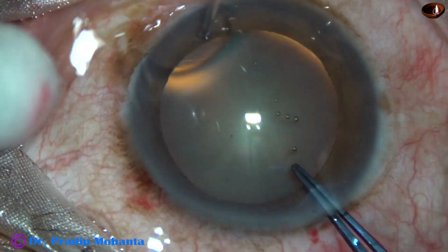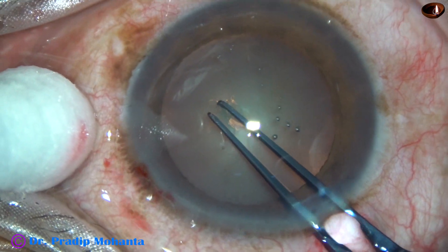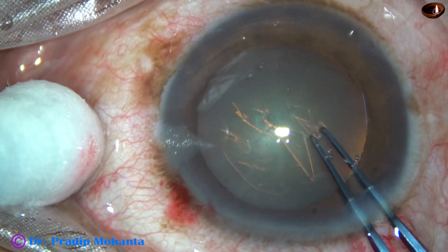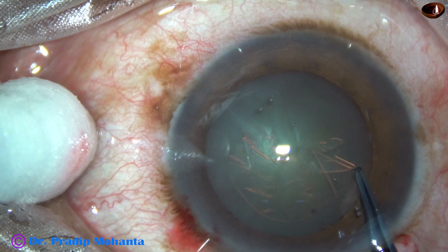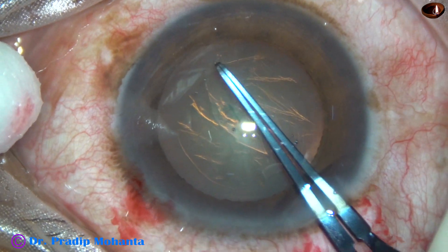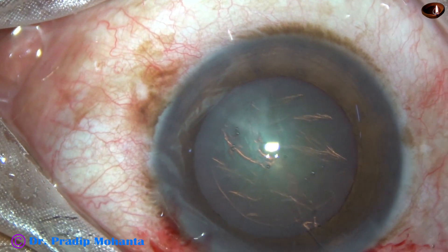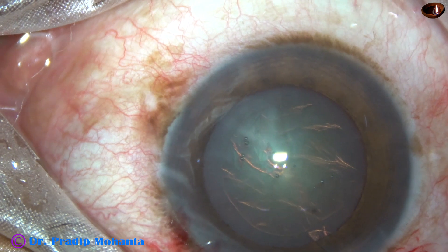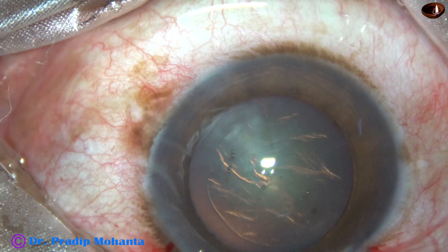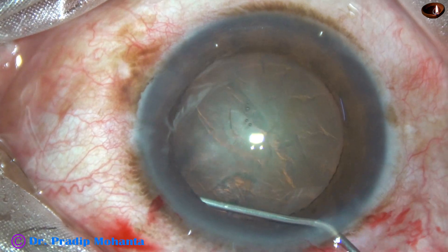Now I'm going to do capsulorhexis. The anterior capsule is torn, a capsular tag is raised, and this capsular tag is guided with the forceps to get an adequately sized rhexis of about 5.5 millimeters. For this technique, the size of the rhexis should be 5.5 to 6 millimeters.